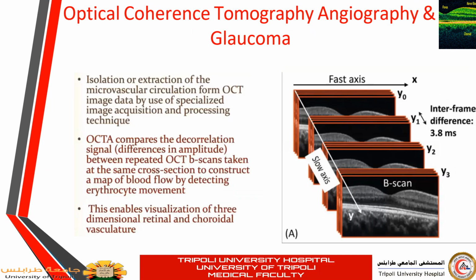As I mentioned earlier, the principle behind the OCT angio is to detect the moving particles or the vasculature of the retina based on special algorithms and software available that concentrate on particular points in the retina, and take a picture of the same point over a very short period of time.